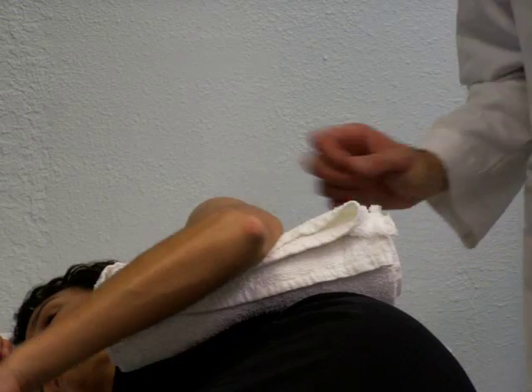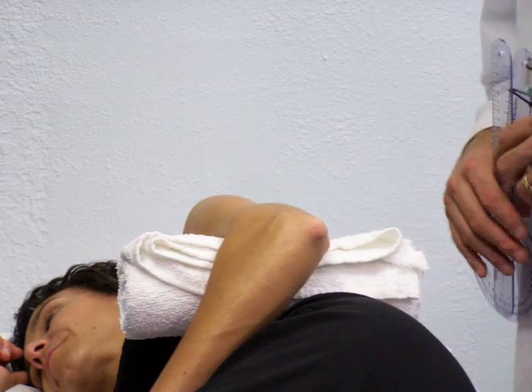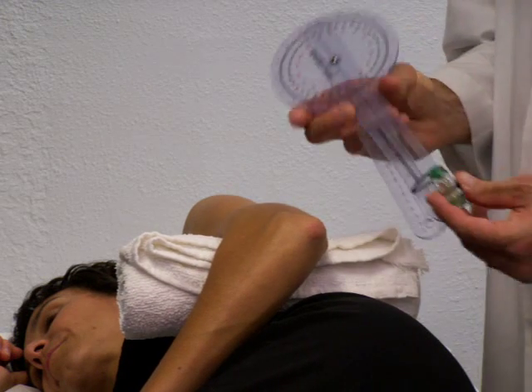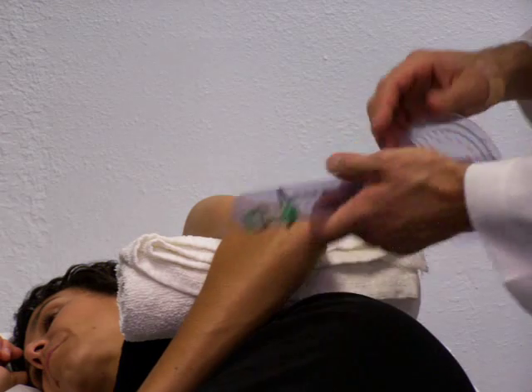Measuring shoulder external rotator strength. This is her left shoulder. We're going to use a goniometer called a universal goniometer. I've actually attached a bubble level to this one, but any goniometer will serve just fine.